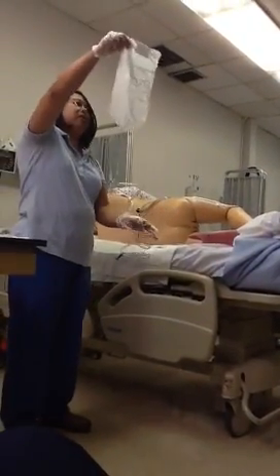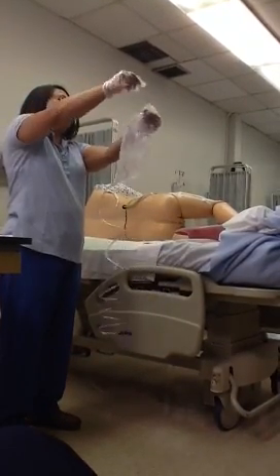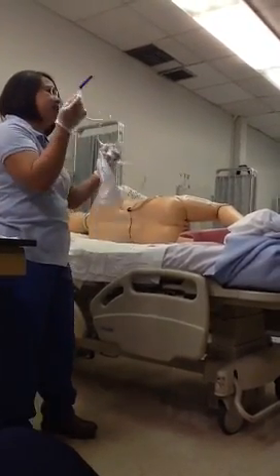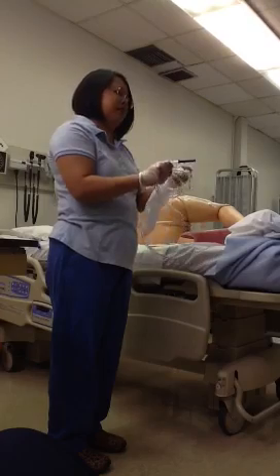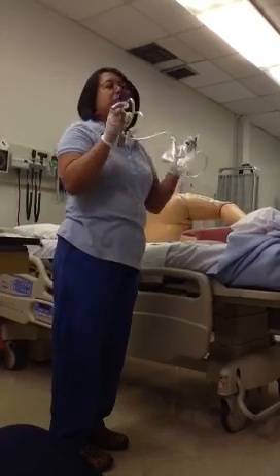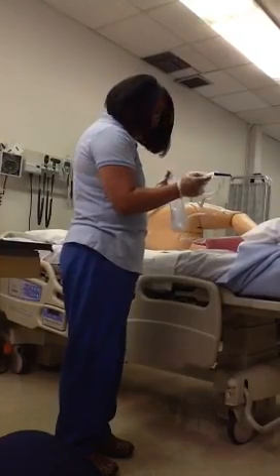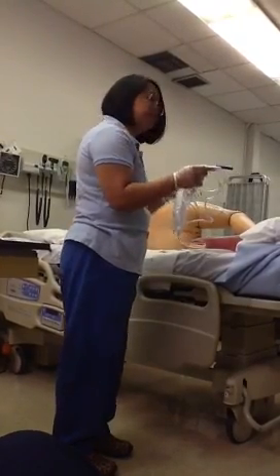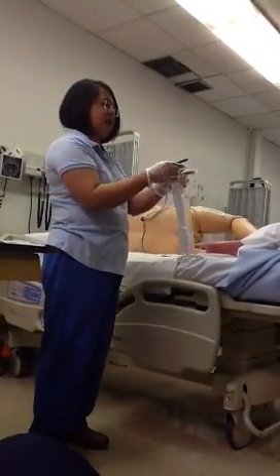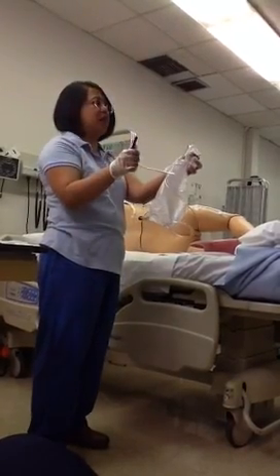All right, so the bag has an opening on the top right here, and then there is tubing on the other end, and then there's usually the cap. Now this particular bag, inside the cap is water-soluble lubricant already, so it's actually pre-lubricated, okay? But if I were you, I will never ding you if you want to apply more. Trust me when I say you might want more. All right, and then there is a clamp, all right? So the first thing that you do when you get this out of the bag is you want to make sure that the clamp is pinching off the tube, just like that, okay?